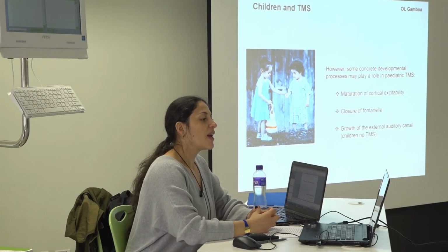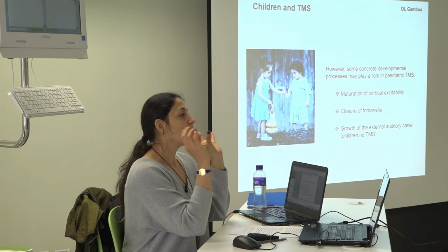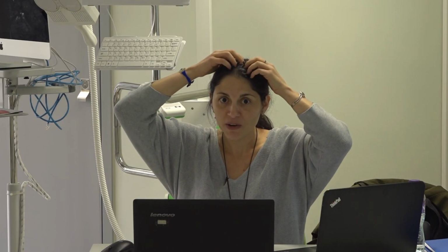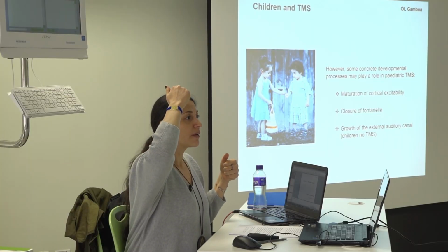because of the developmental things that we already talked about: the brain is already in development, and there are maturation processes coming. When you were asking me about the age, actually I was surprised. I knew this now that I was preparing this study. I haven't talked to anybody who has done it to babies, but in the consensus they say that the closure of the fontanelle, the hole that babies have here, if you apply TMS, you can harm that part. And sometimes it's still soft. I was like, no, I'm reading wrong, this cannot be possible.